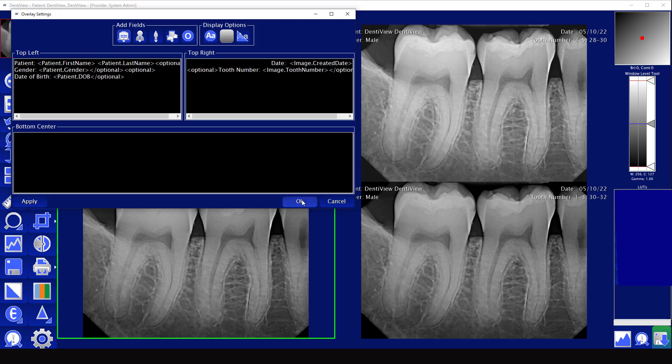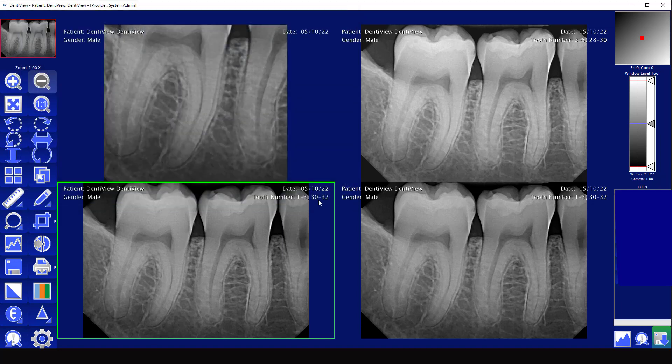Hope that helps with understanding the different tools and functionality inside of the Dentiview imaging software. Hope you guys have a great day.